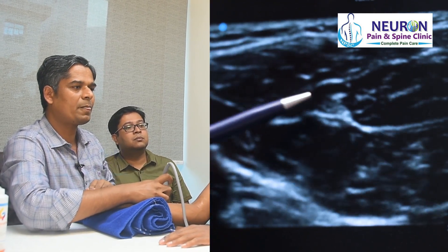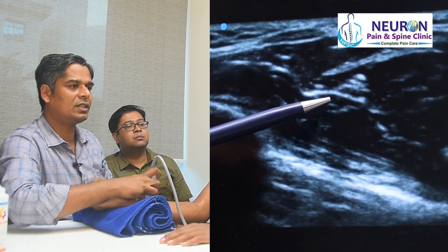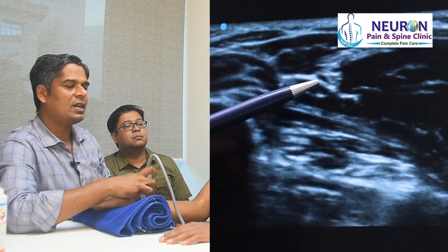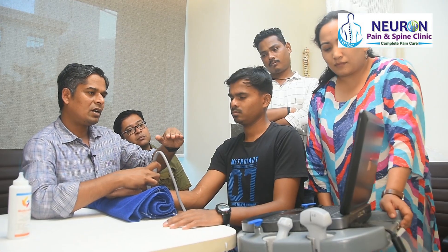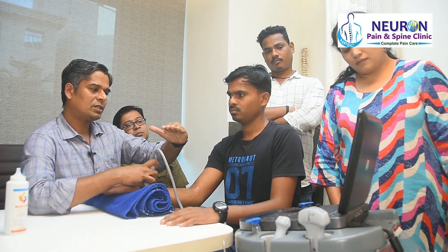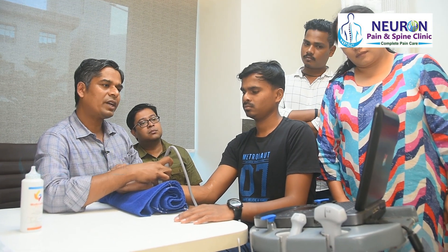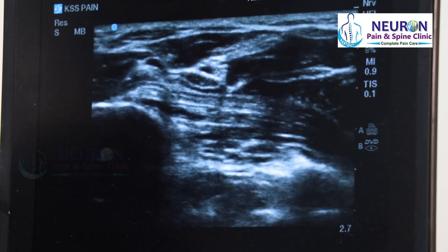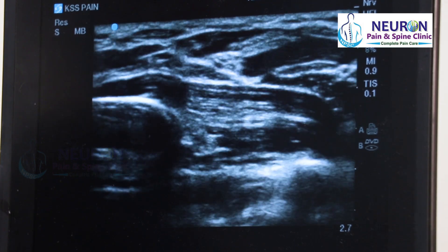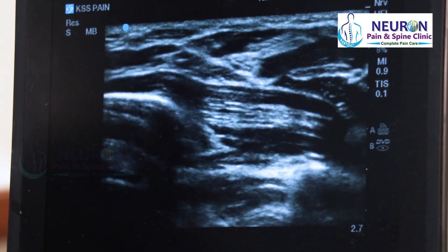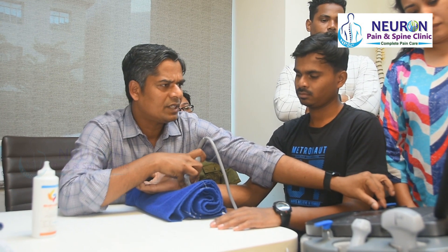This nerve will appear between the FDS and FDP muscles and travel all the way. As I approach the wrist, the nerve travels from a deeper place and suddenly goes up to the surface. For the best image of the nerve, one has to tilt the probe towards the fingers — that is called anisotropy. I'm reaching the wrist there.